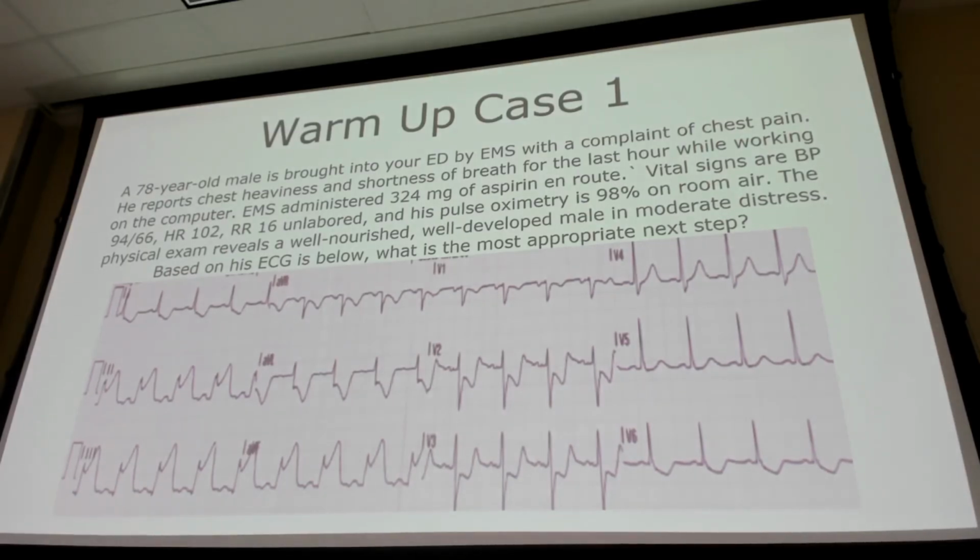Yeah, inferior STEMI. Yep, good. So what do we want to do? What other kind of EKG do we want to give for this patient? Yep, right side EKG. So this is your classic code STEMI. Some places will call it a heart alert, just depending on your facility and whether you have PCI capabilities or not.